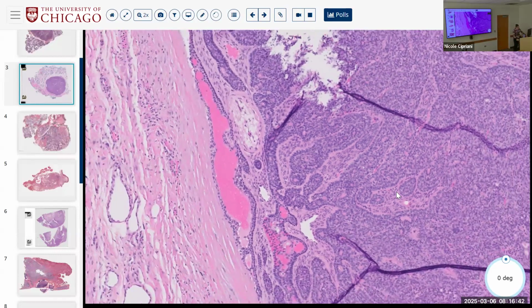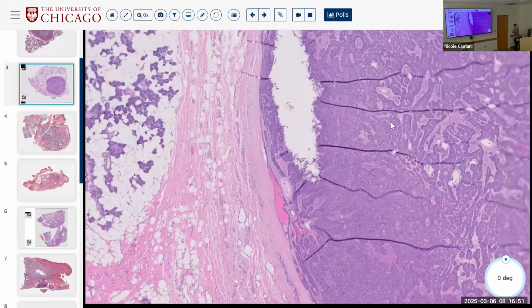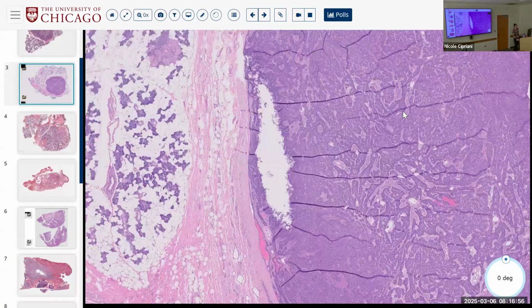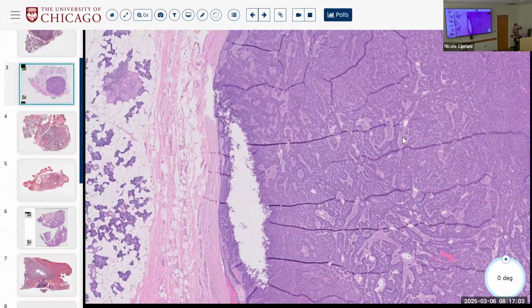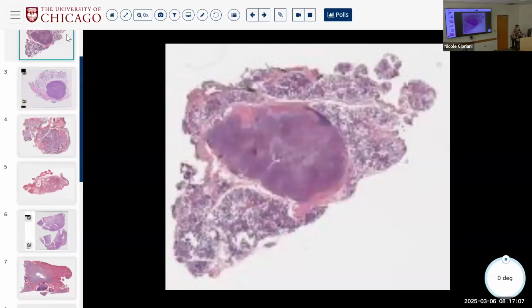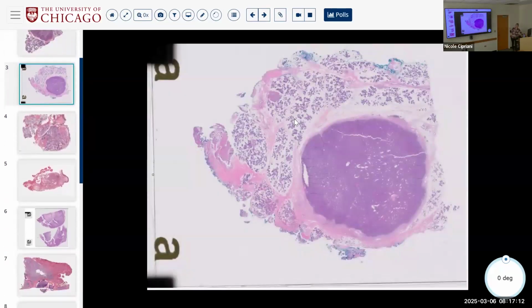Sometimes the architecture of these areas is called tubulotrabecular, right, where you have these tubules and trabeculae, and even these intersecting jigsaw puzzle islands with this cellular spindled stroma. And so, yes, this is a basal cell adenoma. If you wanted to prove it, unlike pleomorphic adenoma, which is probably this one, what is the genetic profile of most basal cell adenomas?